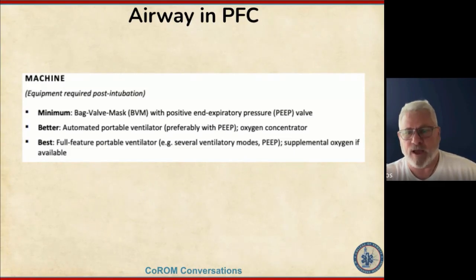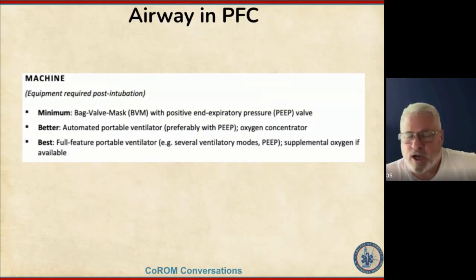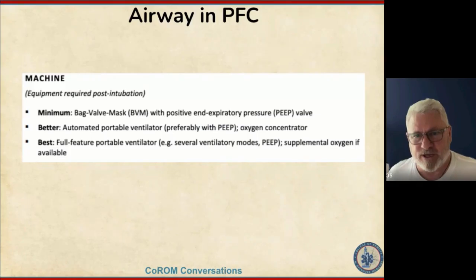You should have a BVM and a PEEP valve at a minimum. Better is if you have something like a portable ventilator or oxygen concentrator that you can use for supplemental O2, and then, you know, best would be a full-feature portable ventilator that you're trained on. Caveat, you need to be trained on it. Just don't have the cool one and you have no idea how to turn it on or make it go beep.